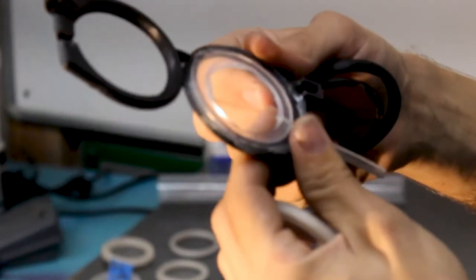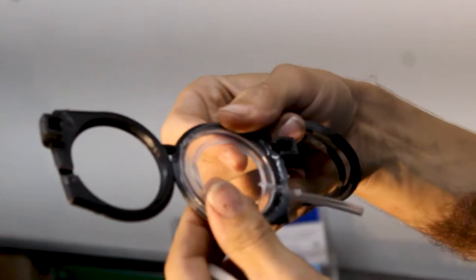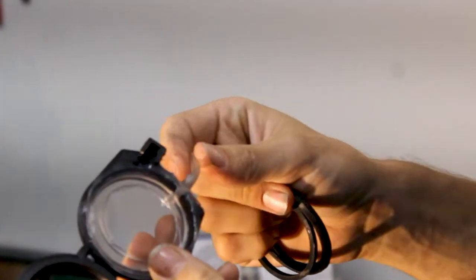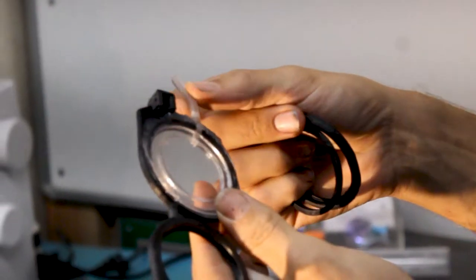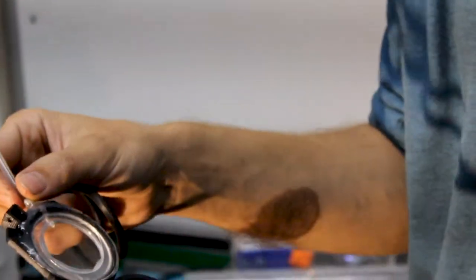I had a lot of different prototypes over here. So I started with this, this was the first one I made. It just used hot glue to seal the lens on. It was kind of leaky, and it used this hose. And I'm kind of trying to get away from using parts that aren't really easily accessible.